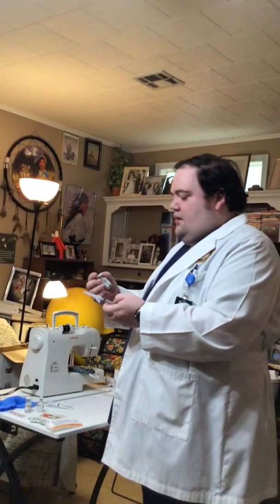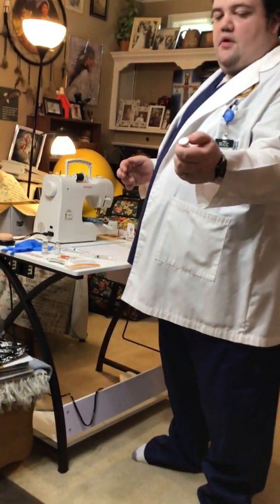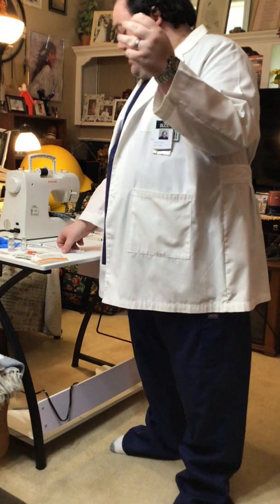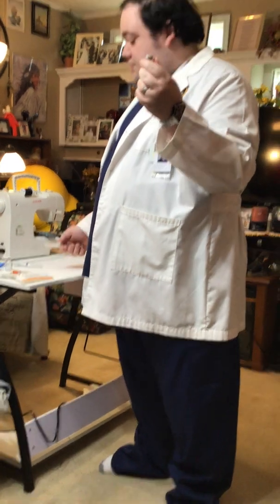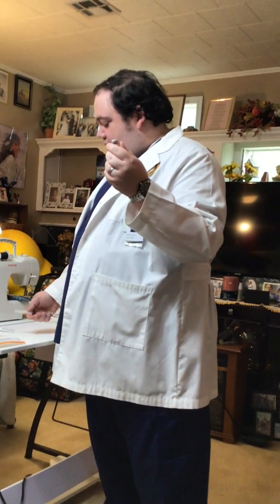All right, this is a multi-use vial, and you can see the cap is still on it, so I don't need to sterilize it, because it's never been used before. So I'm simply going to take the cap, flip it off. Now if I touch that stopper in flipping it off, I have to sterilize it. But we don't have to sterilize it. So I'm going to take the cap off of my needle.